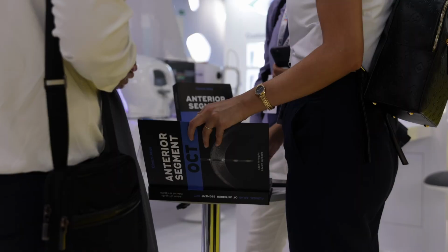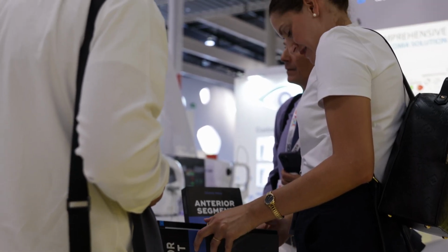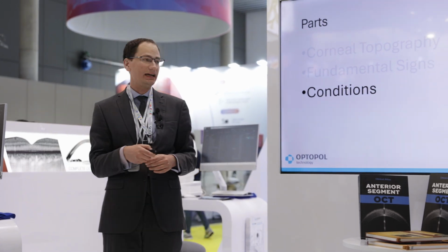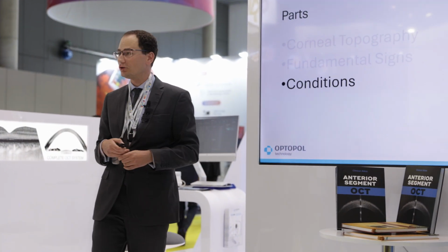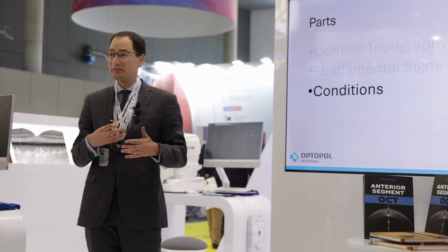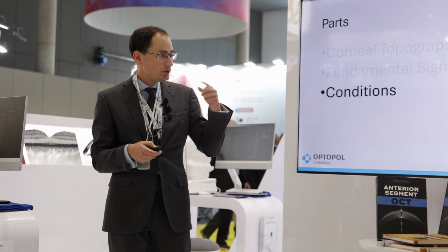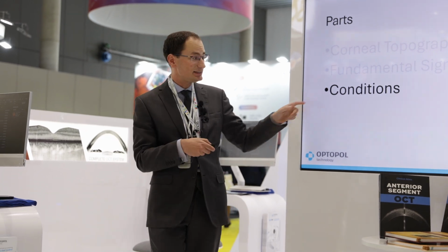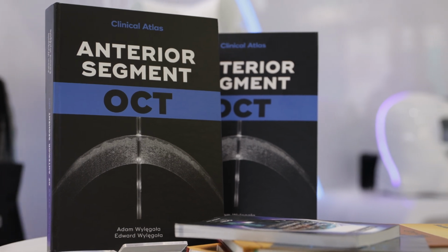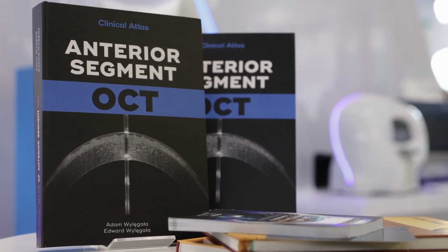The most important one is obviously the conditions. So different conditions, corneal dystrophies are also presented. So for instance, this patient has an acute ocular burn with alkali. You cannot see anything. In the fundus, there's no fundus reflex. If you do the corneal scanning, you can see that there is the Descemet membrane detachment due to the hyphema. So it's basically all the conditions.